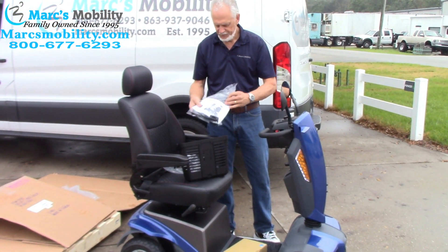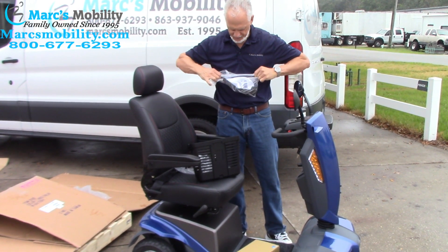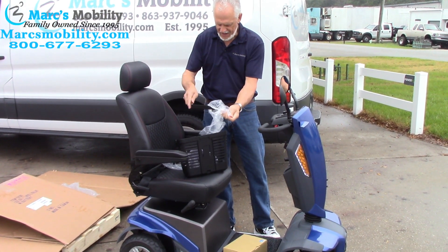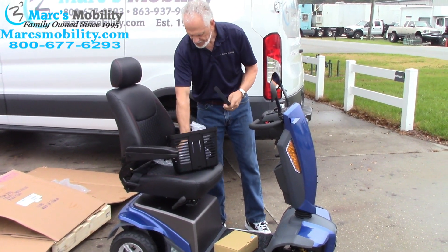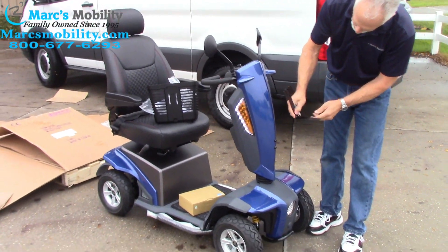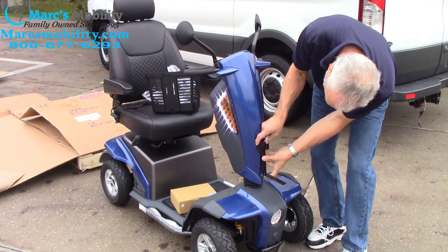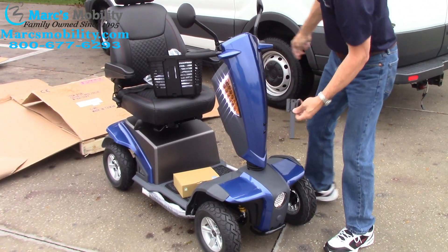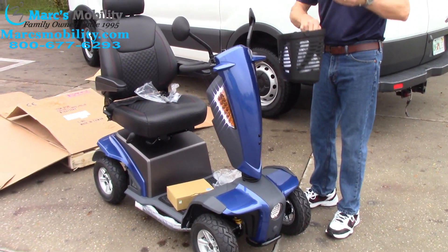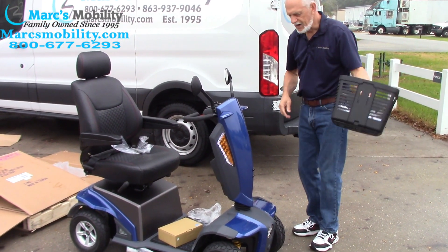We have the basket here. The basket comes with screws — that's one thing you'll have to do. There's your owner's manual. You have your screws here and your basket will mount somewhere over here — probably down this way. You will mount your basket on the bottom like this. You have your basket mount right here for your scooter. I'm not going to be able to mount that on there now, but it's not hard to mount.